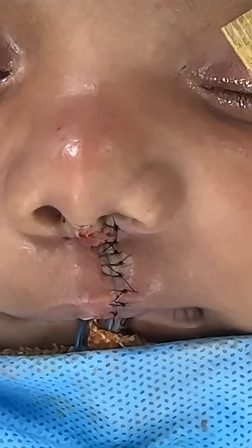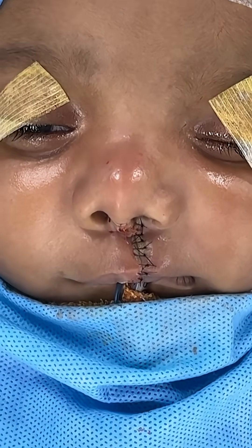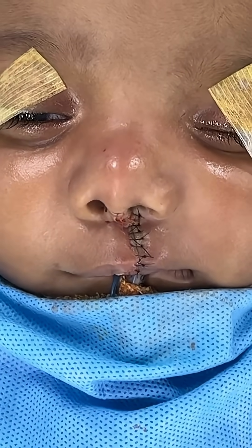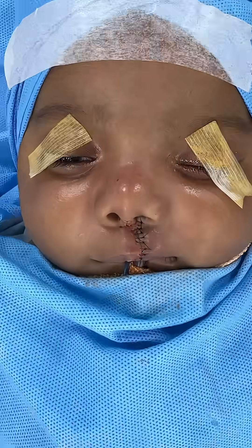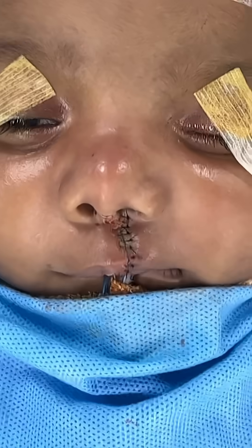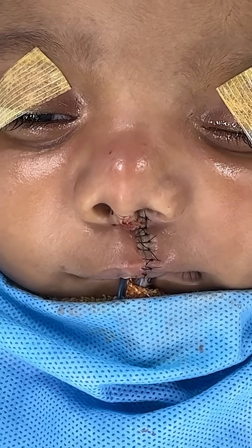Total symmetry has been achieved. This is a clip from before we started. I keep telling patients it's like you just have to unfold the muscles from the wrong place and reinsert them in the correct place where they should have been. That's what we have done.